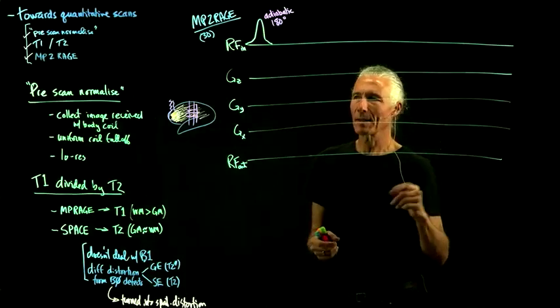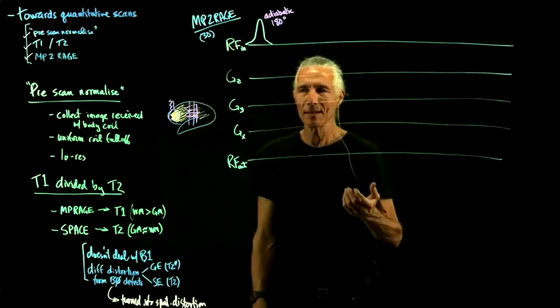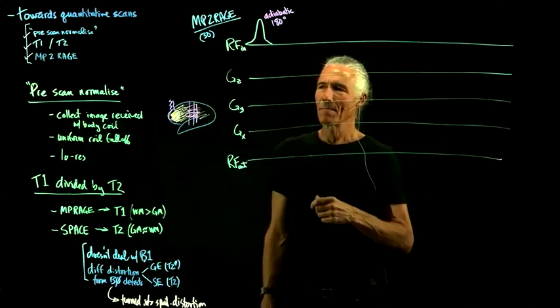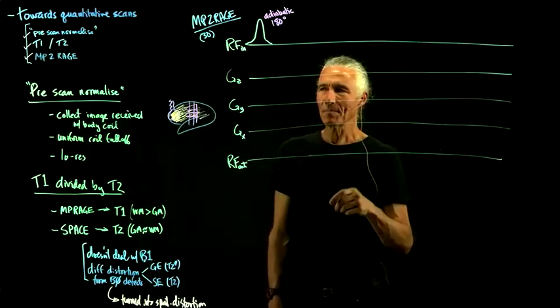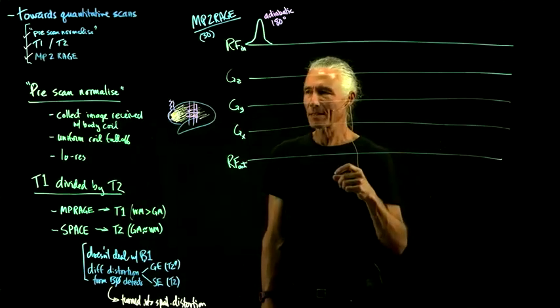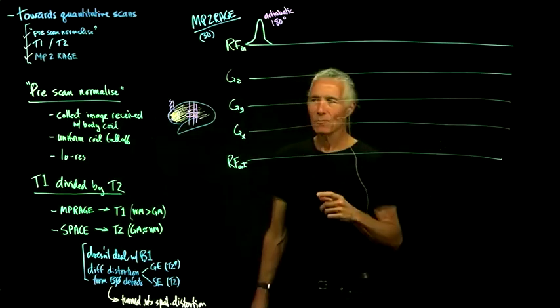We'll talk about that a bit later, but that's one way of causing an inversion in the magnetization: start off resonance, come through resonance, and then go off resonance in the other direction. Surprisingly, that will do a really good 180.